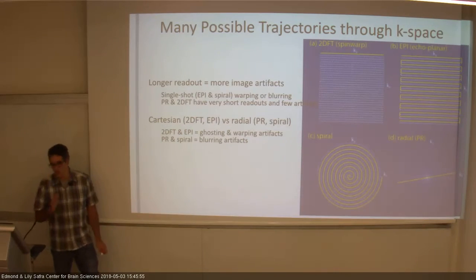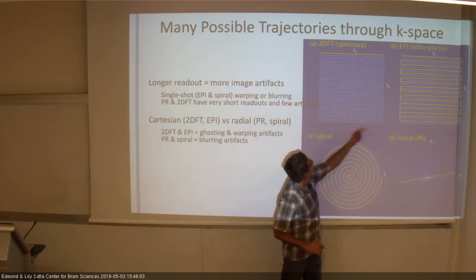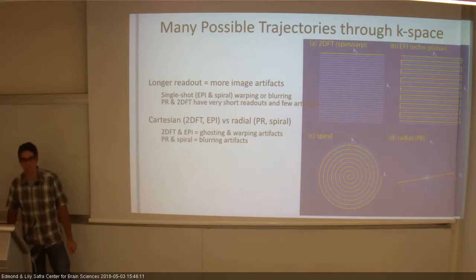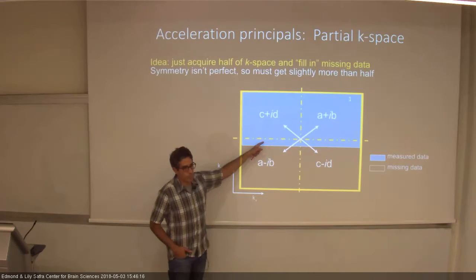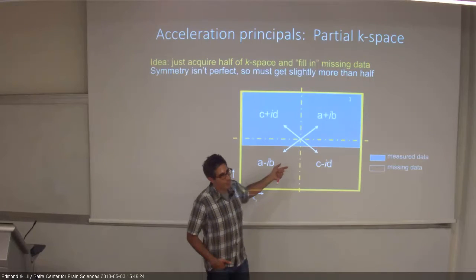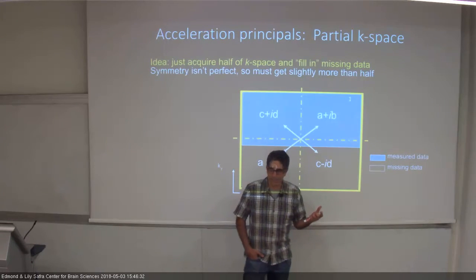And people are inventing many ways to go through K space: spiral, EPI, other things. And people use many things that we know about Fourier space, that there is symmetry in Fourier space. So maybe we don't need the full K space, the full Fourier space. We take some of it, and then we say, oh, there is symmetry, we're just going to project. All of those things are a way to kind of, if you want, I lost the word.